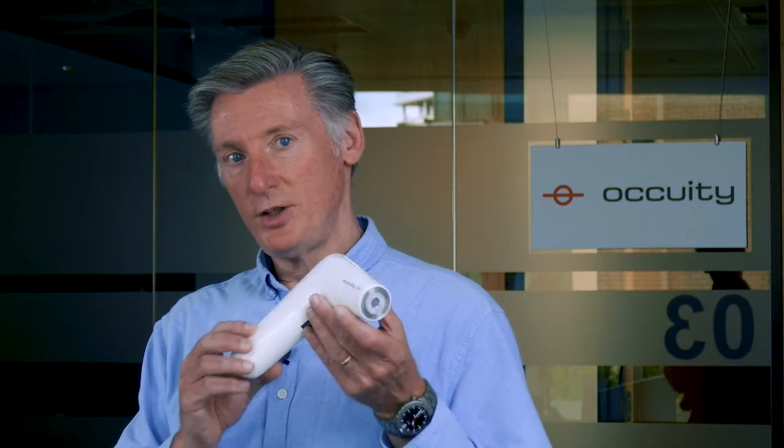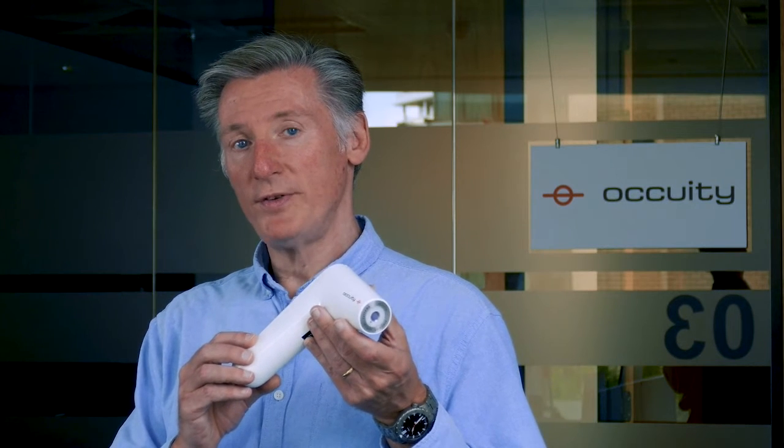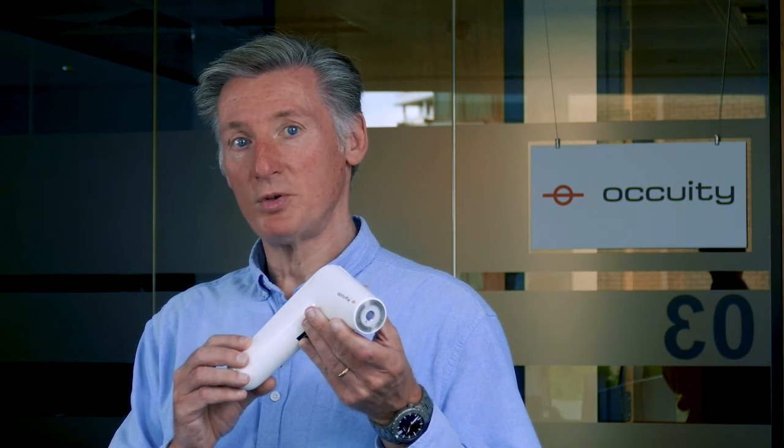Hello, I'm Dan Daly, one of the founders and CEO of Occuity Limited, and this is the Occuity PM1, the world's very first handheld non-contacting optical pachymeter.